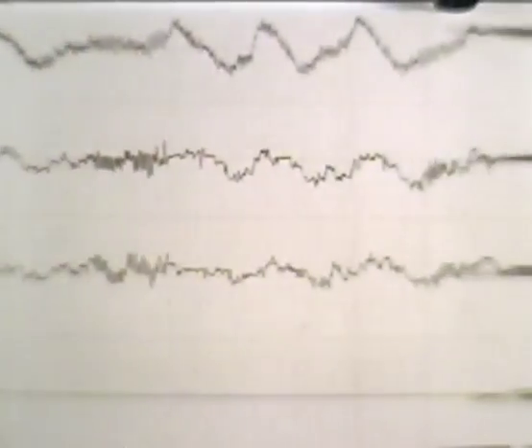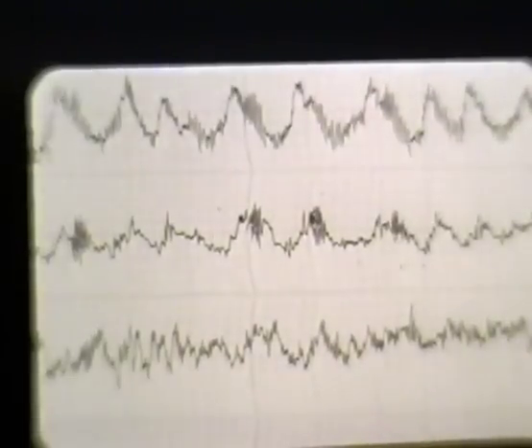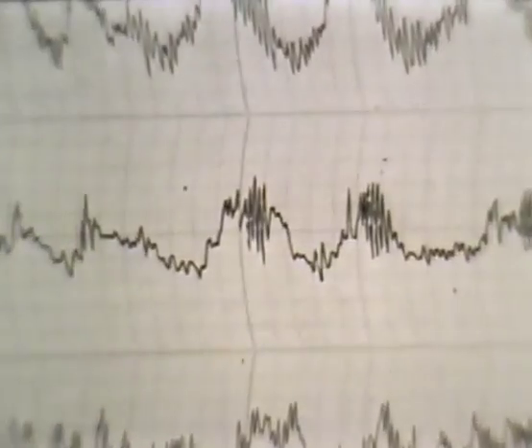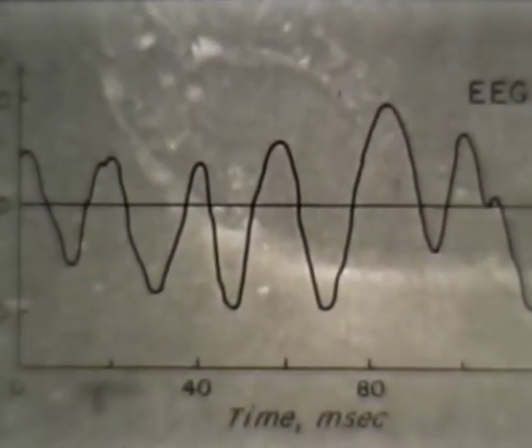Next, we will observe patterns of spontaneous or background electrical activity recorded from the bulb and from the cortex. The pattern under anesthesia shows small bursts of activity at approximately 40 to 60 cycles per second. The recording period lasts approximately 1/10 of a second. Therefore, the display is restricted to the duration of a short burst or to a part of one burst consisting of several cycles of oscillation.